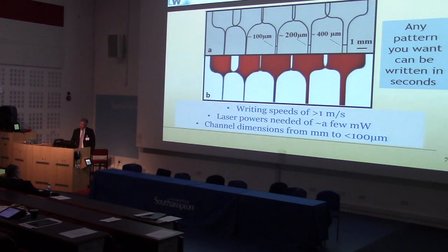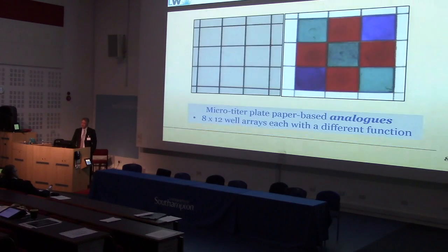And that indicates it would be cheap in the end. For the area of AMR, however, you may want to have flow channels, you also may want to have wells. This shows just a crosshatch, a checkerboard of polymerized walls. If you've got different colour inks in these regions here, they don't mix. So if you could have the biochemistry inside this well area here, you would test for nine things.